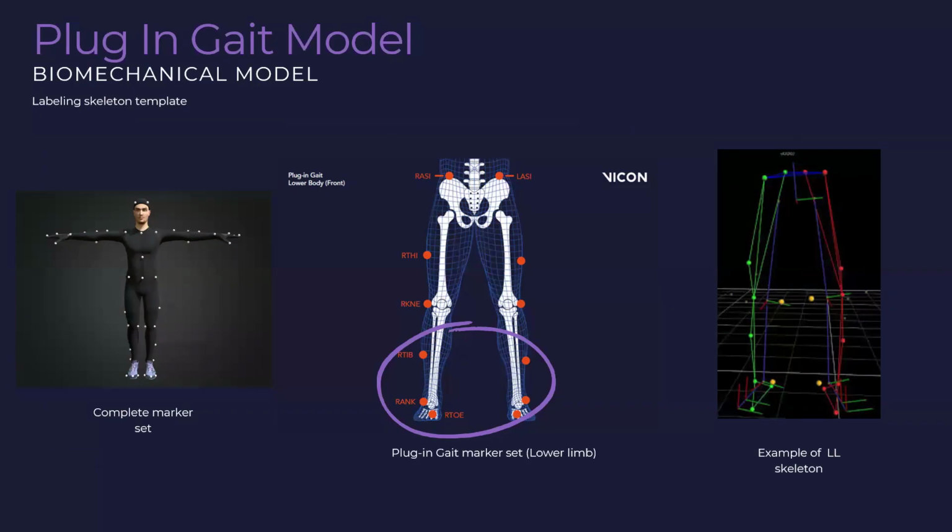And the other thing is about what you said about the force plate. So you're talking about kinematics, and then one dynamical aspect, which is the force plate. And you measure the force, but you said you measure the COP. Yes, because we have the models. So what does the COP indicate when you measure it in a gait analysis?